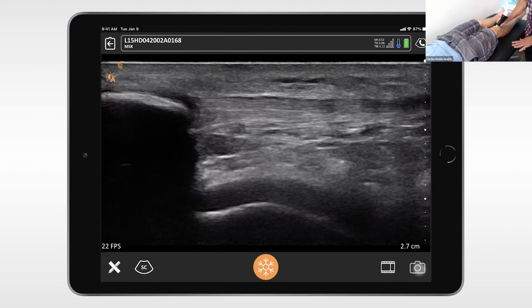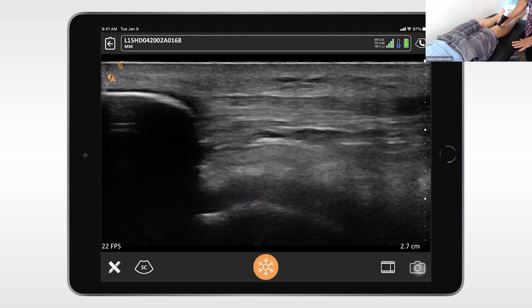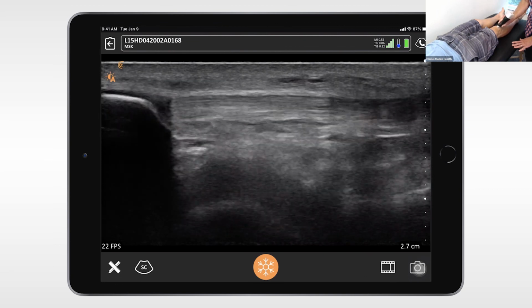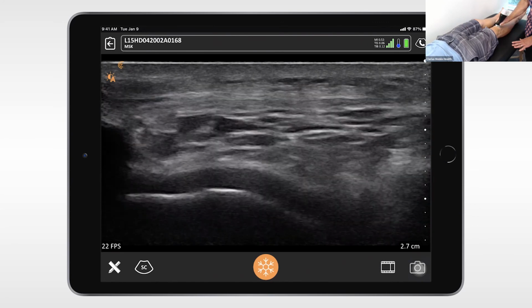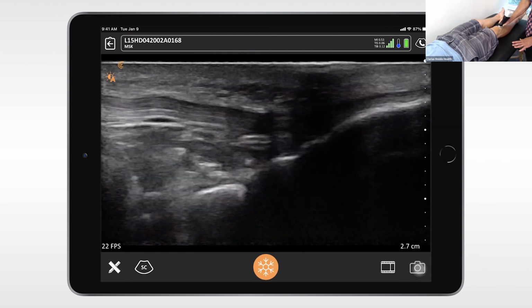There's the patella. And I like to operate by the see one, do one principle. So now I saw one. So here's my patellar ligament, right? And I'm going to make sure to sweep all the way across. Of course, I would probably be going slower in a real patient encounter to really make sure I'm looking for subtle findings. And then coming down all the way to the tibia here, the insertion.